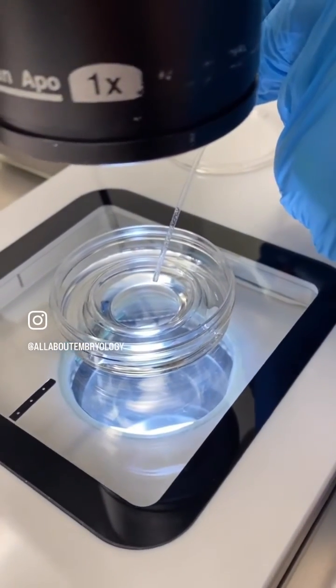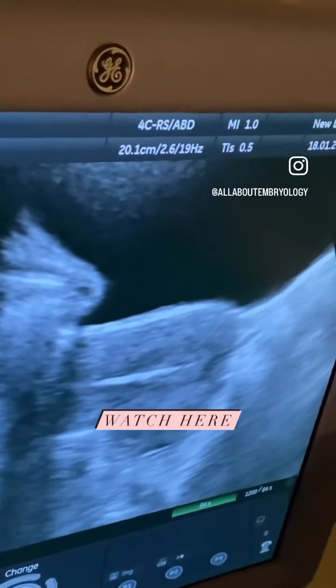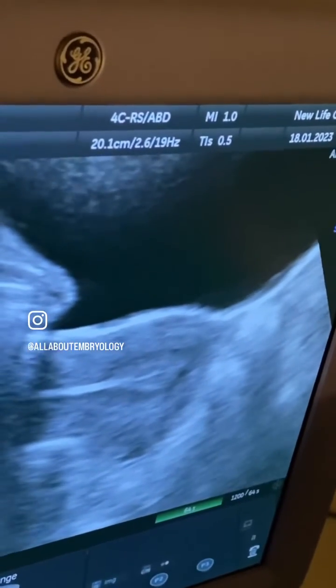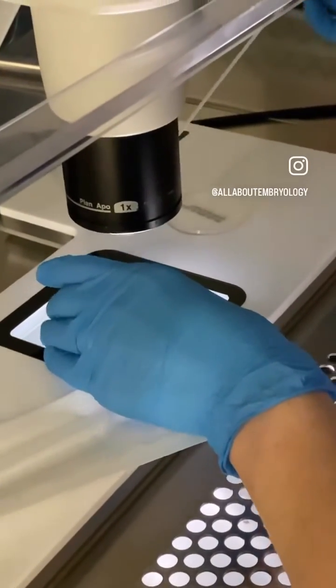The loaded catheter can then be passed through the outer guide catheter and into position. Here you can see where the embryo is released by the bright flash — that is in fact the air bubbles either side of the embryo. The catheter is taken back into the lab to ensure the embryo has been released. It's all clear!